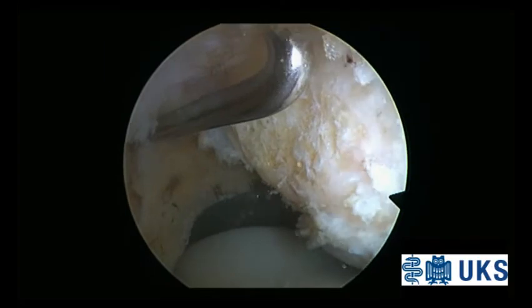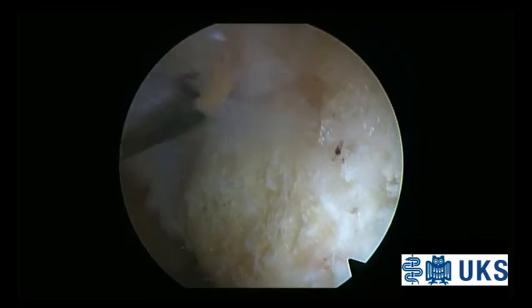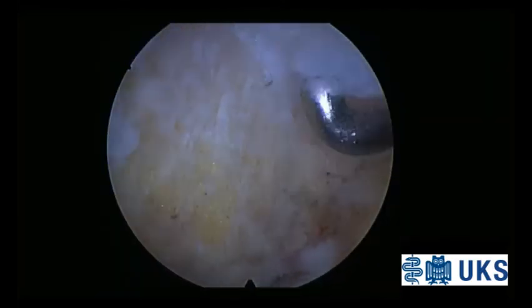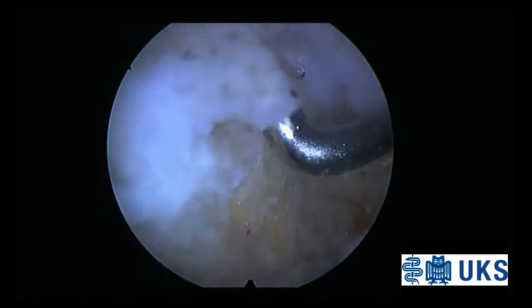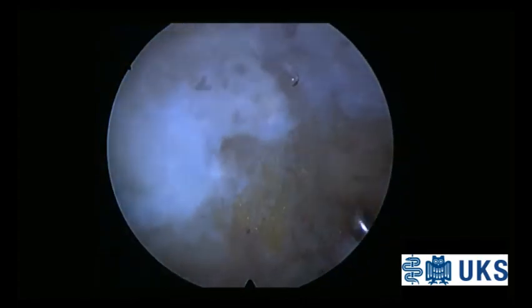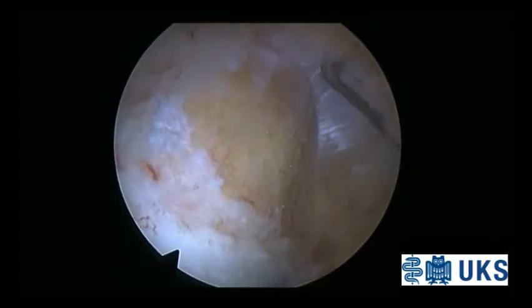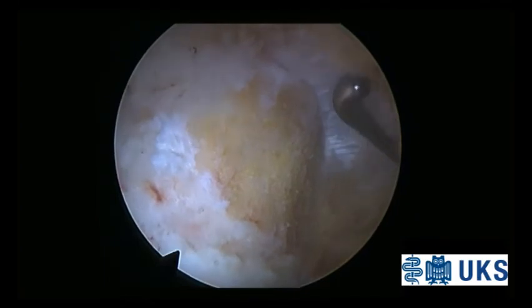The final arthroscopic evaluation is performed after resection of the pathologic soft tissue as well as removal of the bony lower patellar pole. The extent of the resection is controlled arthroscopically and fluoroscopically to avoid treatment failure due to over- or under-resection of the lower patellar pole, or residual small bone peaks in the anterior part of the lower patellar pole.